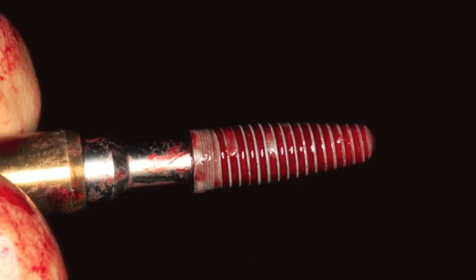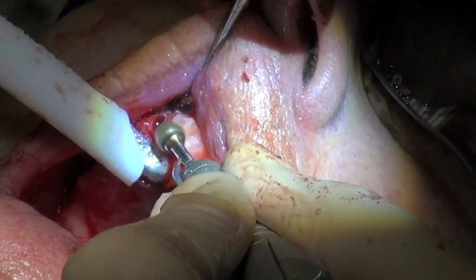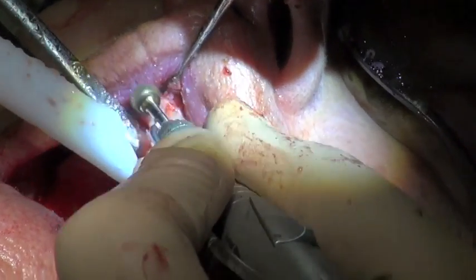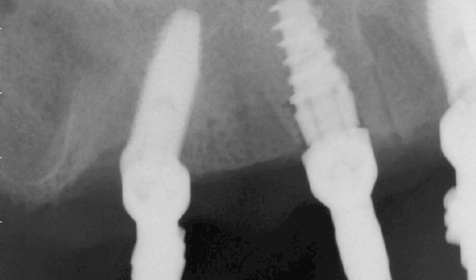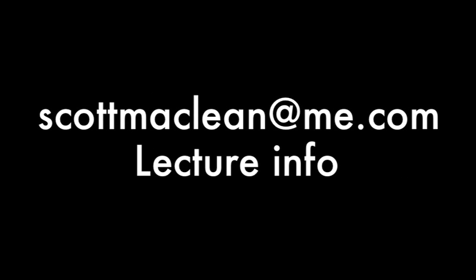You can see how nicely this integration was going on — it really grabbed on quite nicely. Now we'll reduce the ridge, go back in, and finish the all-on-four. We get the prosthetic space we need and replace the implants at a slightly deeper level, which will enable us to have the titanium bar, multi-unit attachments, and all the things needed for all-on-four. This is Dr. Scott McLean and this is a YouTube presentation about implant dentistry.